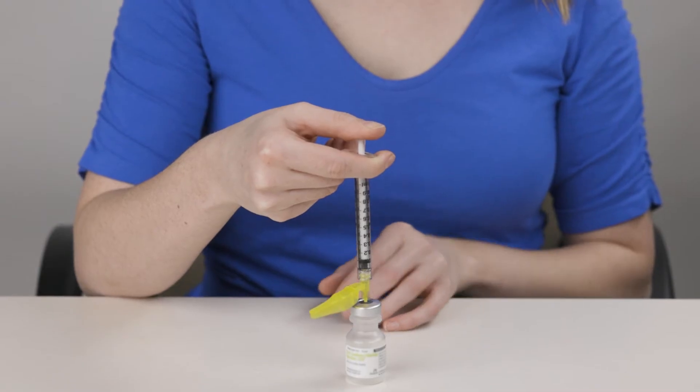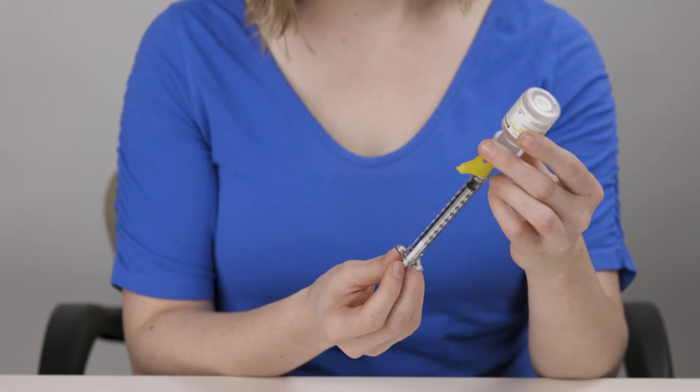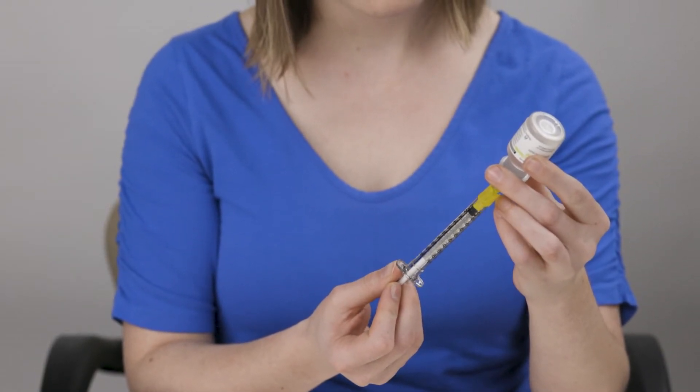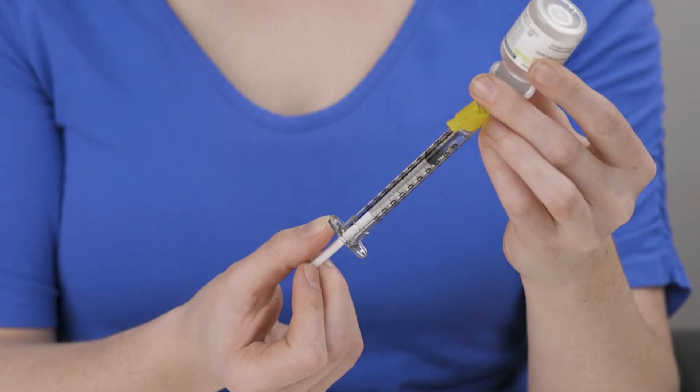Keeping the needle in, turn the vial upside down and make sure the tip of the needle is in the liquid. Slowly pull back on the plunger until the correct dose of medication has entered the syringe.